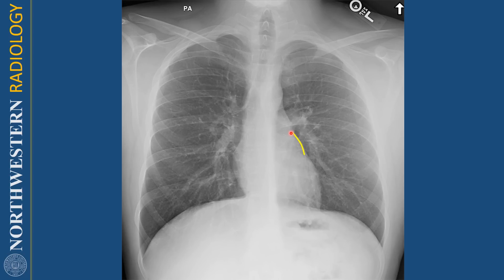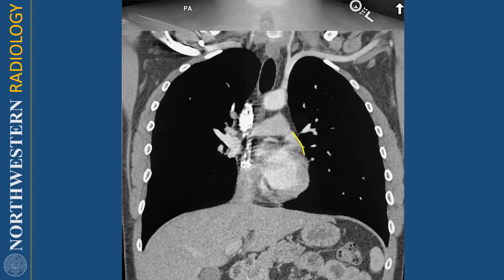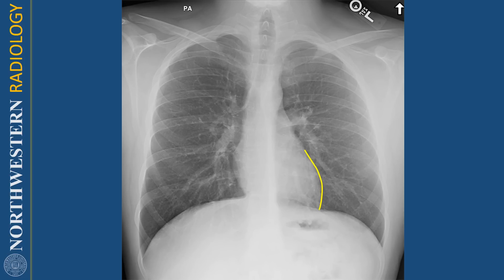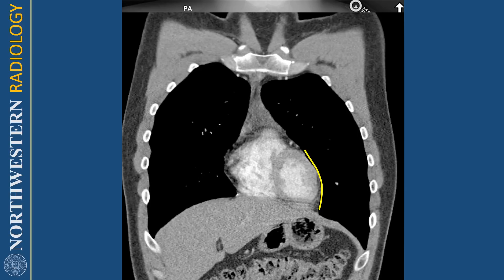Going down from there, we have the left atrial appendage, which forms this contour here — it's the top part of the heart. Here is the corresponding CT showing the left atrial appendage. And then this is the left ventricle. The left ventricle forms the majority of the left heart border on the frontal radiograph. Here is the corresponding CT showing the left ventricle.